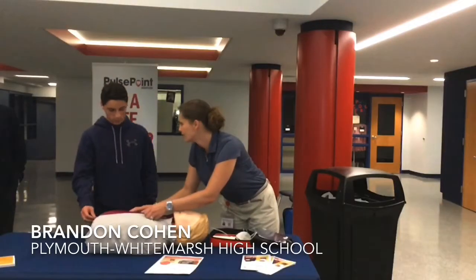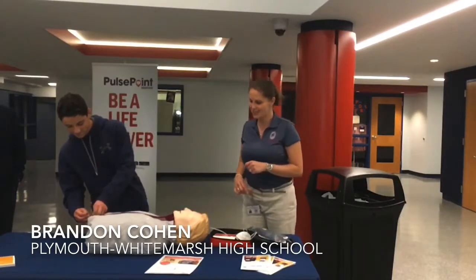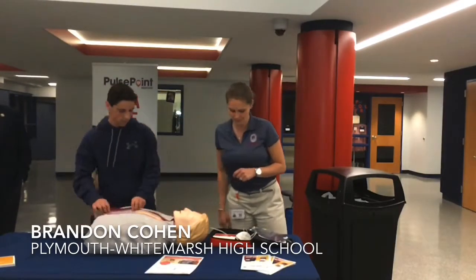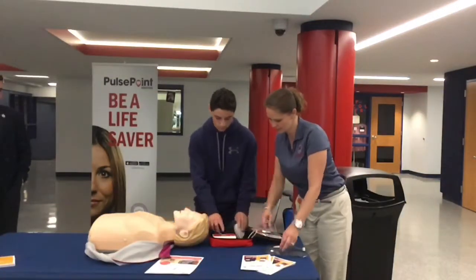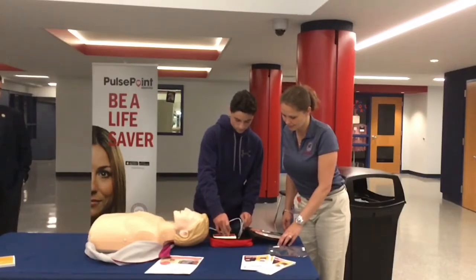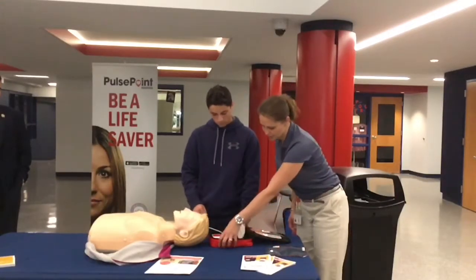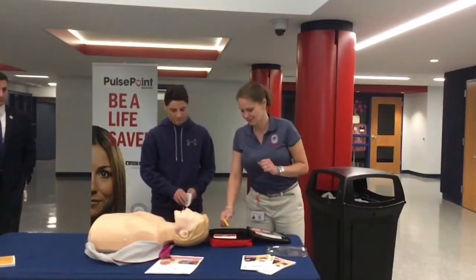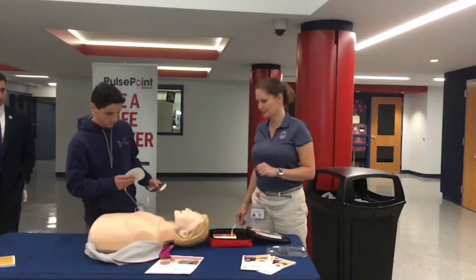What's the very first step? Call 911 — make sure 911 is on the way. So then we're going to disrobe. Here's the power button.